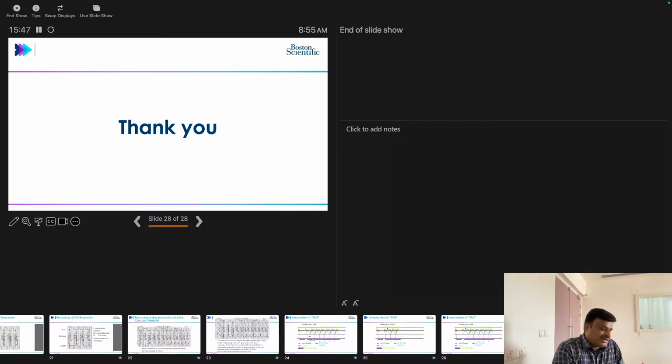If you are active with the patient, you carefully look at the VA conduction time. How are you going to see the VA conduction? In our programmers, we can initiate VA conduction by doing the retrograde conduction test, and we can do that, sir. So you are doing routinely?